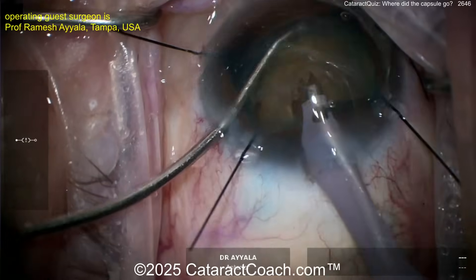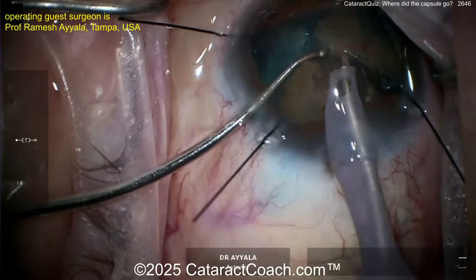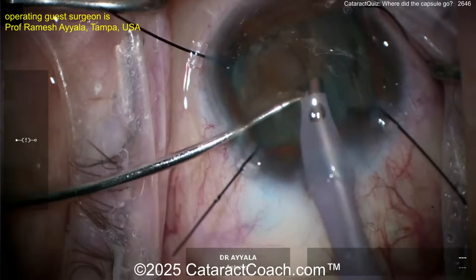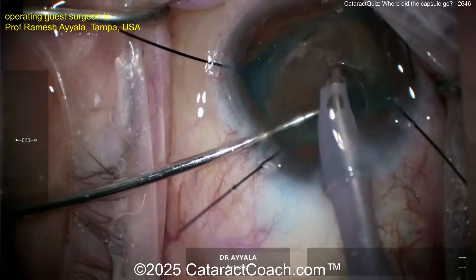Now the phaco probe is going in. You're saying why use it? Why the bigger tip? Think about it — you're going to put a 40 diopter lens and you need a bigger incision. Groove down the middle, perhaps a bit of a chop technique going on here. Very nicely done.